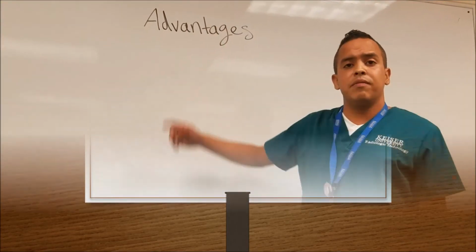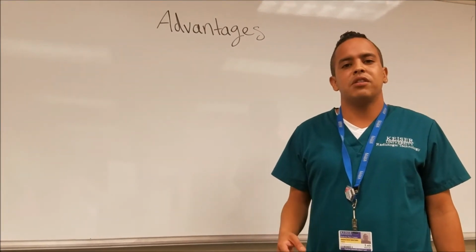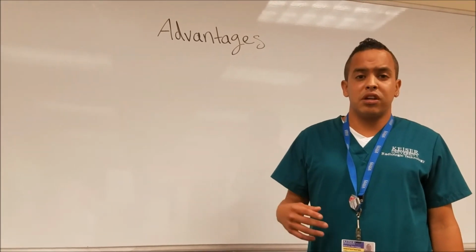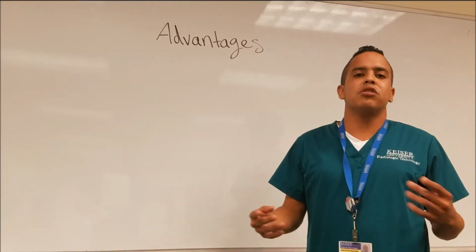I'm going to talk about the advantages of fluoroscopy. One of the advantages of fluoroscopy is that it allows the physician to see a real-time image of internal organs and structures, allowing observations of organs, their size and movement. Also images of the immediate and the ongoing movement of surgical procedures.